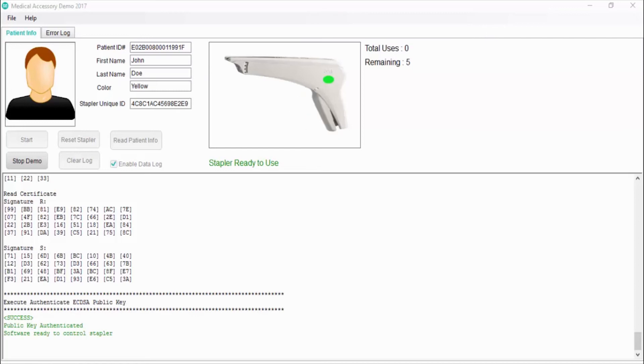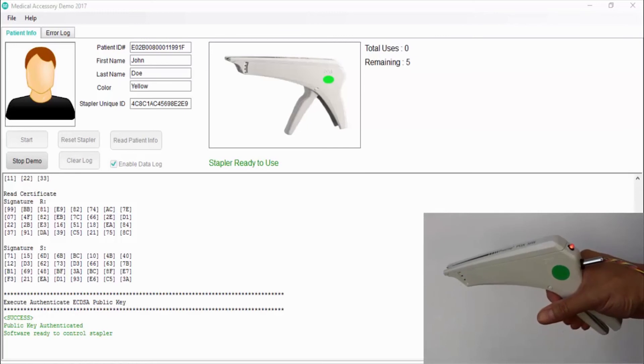Now that the stapler has been programmed with the patient's ID, it is ready to be used. For purposes of this demo, the stapler has only five uses, and this is a secure value that can only be decremented and cannot be reset. Let's use the stapler three times, and then interrupt this patient's procedure to demonstrate what would happen if the stapler is used with a different patient.